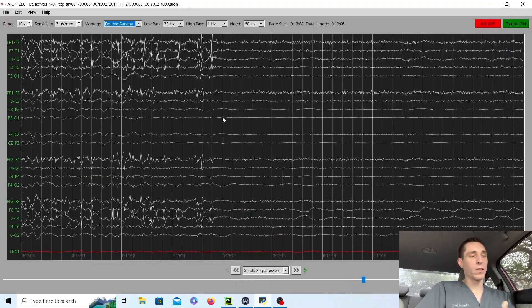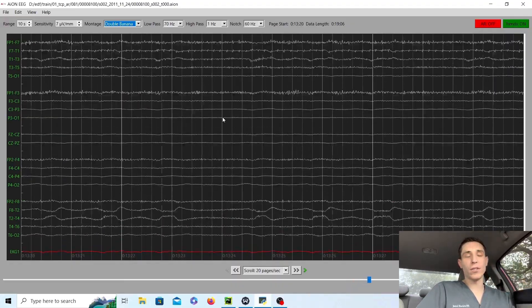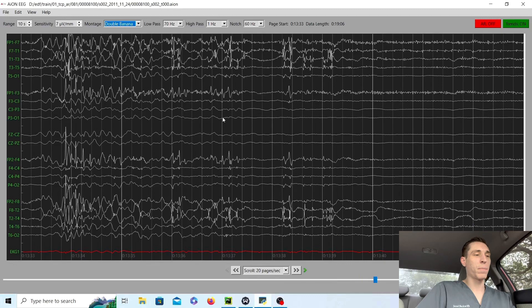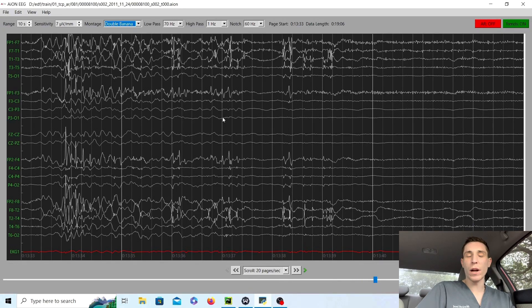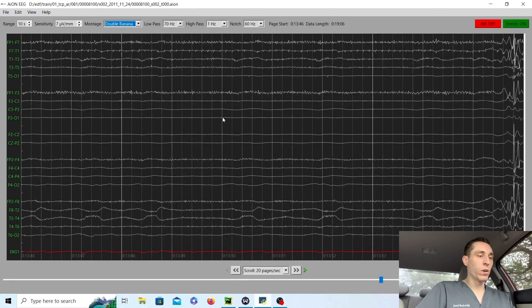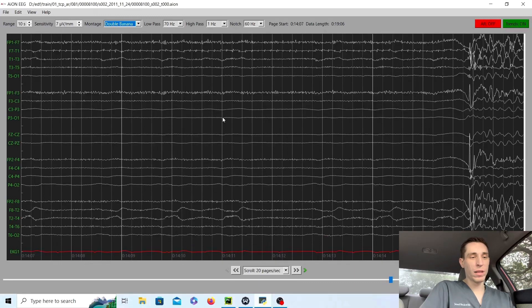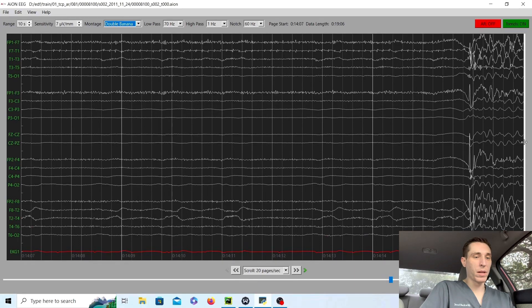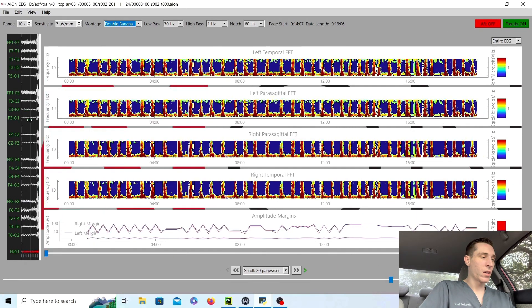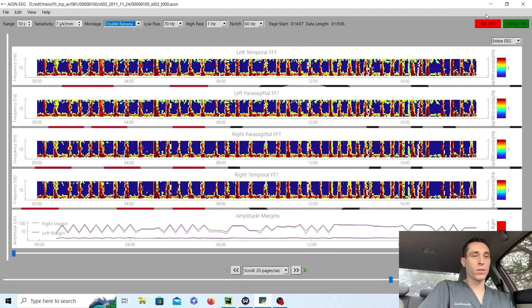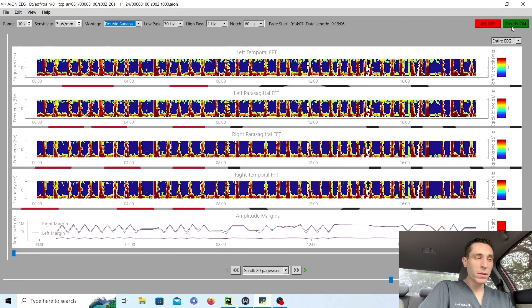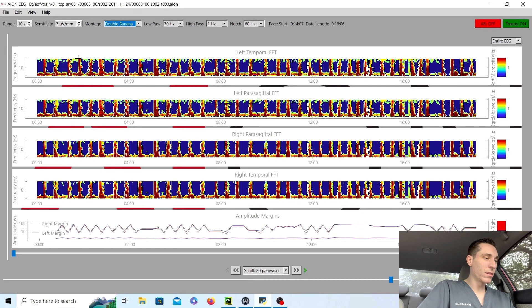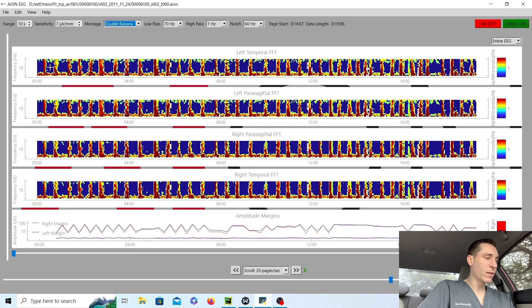And the doctor in the history said that the bursts happen at least 20 times throughout the record. And if you want a quick way to see exactly how many bursts and the frequency of the bursts, you can pull up what is called the Trends tab. And you can see each of these red lines is one of the bursts. And each moment in between is the suppressed part.